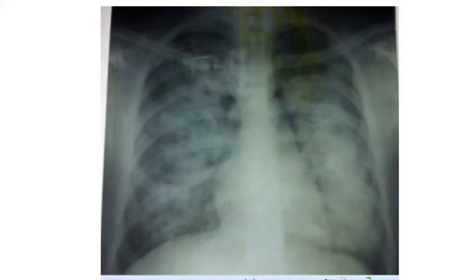Right. And okay, there is alveolar edema, sir. There is a bat wings appearance. Significant, yes. Pulmonary venous hypertension is there, sir.